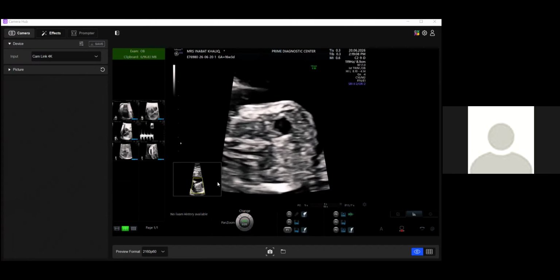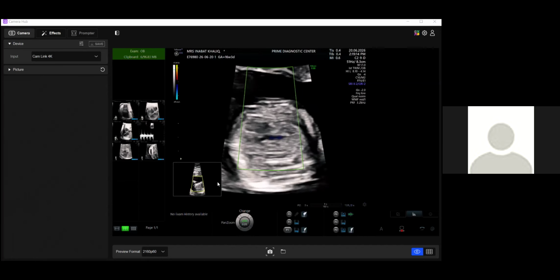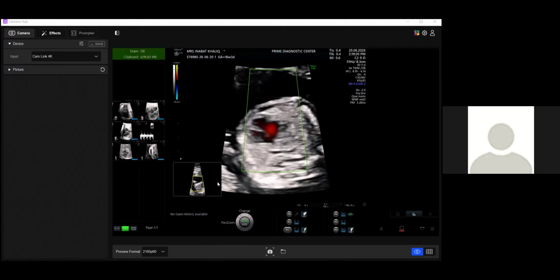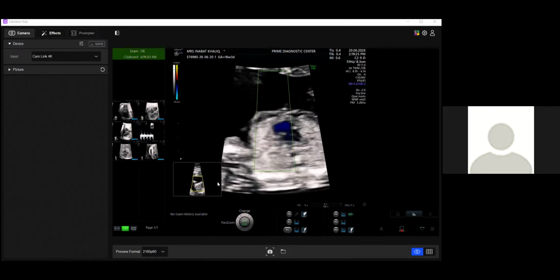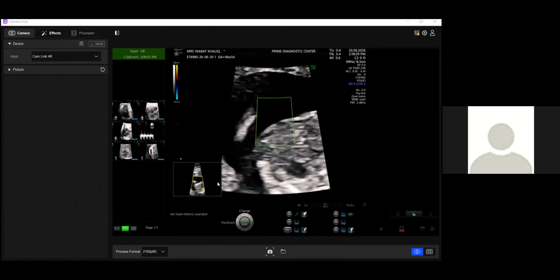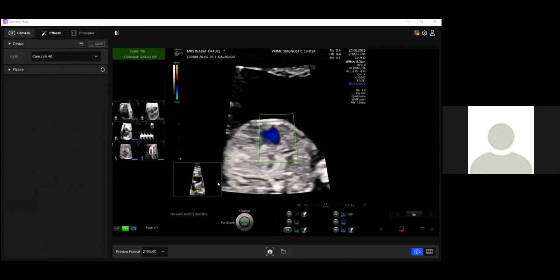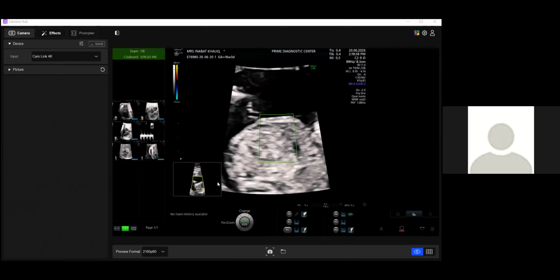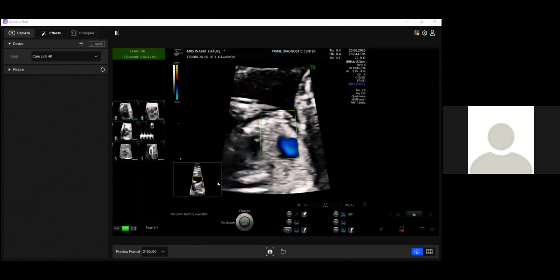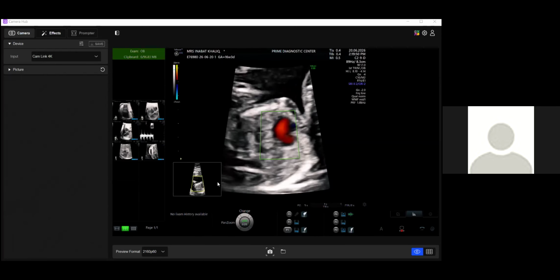So again, start with an abdominal view. And the fetus again is moving, so you don't have to wait. Many times you can scan the fetus when it's moving, have a rough idea, and then wait for some time. As the gestation is about 16 weeks, the Nyquist limits are going to be different. Your Nyquist limits are far lower than you would have in 20 weeks or 30 weeks, where the velocities tend to increase as the gestation grows. So here you will keep the velocities low.